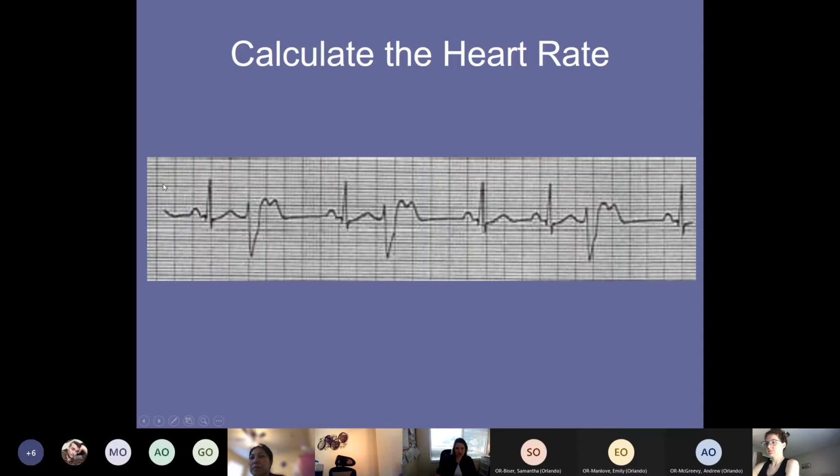And then the same thing, we actually have our QRSs here. We have PVCs here, but these are still QRSs, so we're going to count those as well. When we look at this beat, just kind of going forward, because you've had this lecture before, we've got our P, we've got our QRS, and we've got our T. This is following the bundle of His, bundle branch pathway, that fast highway. It's nice and narrow. This one is going cell to cell, and it's wide, and it's taking a long time. So that's your PVC right there.